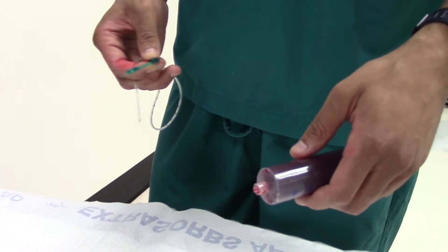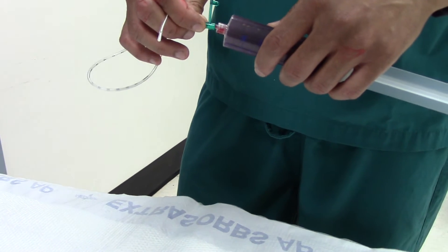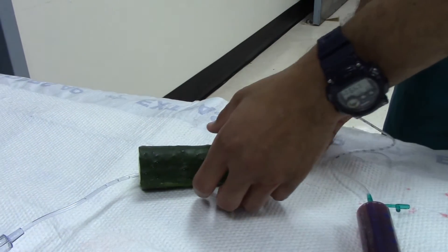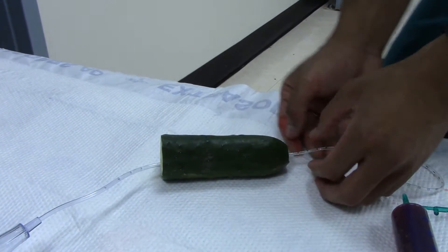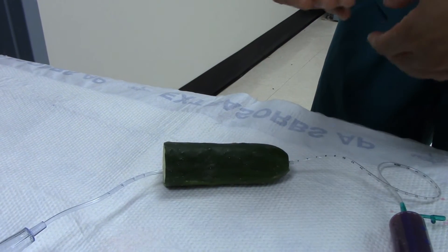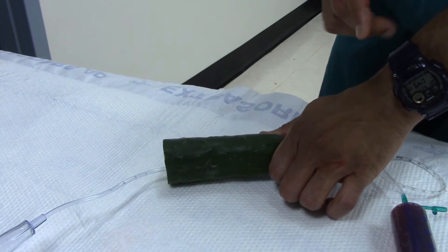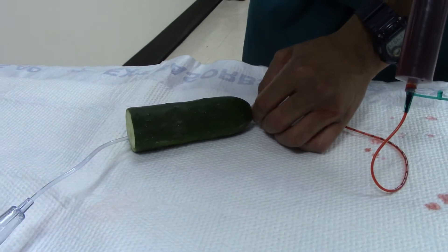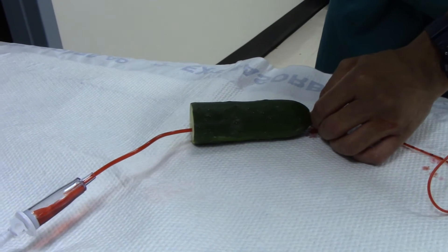Take about 60cc of contrast — some sources say undiluted, some say diluted. Take your small tube, insert it into the urethra about two to three centimeters. You'll need to prevent extravasation by putting pressure along the glans penis to make sure everything goes forward. On our low-fidelity model, I'm just going to press at the mouth.